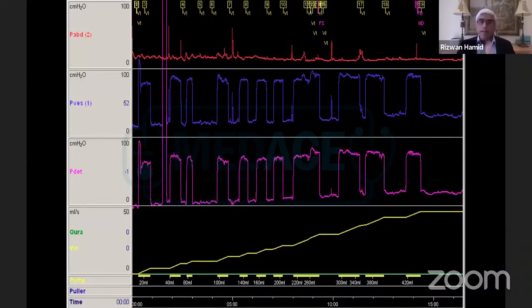I'm going to go back to saying it's pattern recognition. So some of you who have not seen this before say, what is this? Either this is not done well or I can't understand. On the other hand, those of us who have done this test, even if I've not told anything, given no history, would straight away say, this is the urodynamics which is done via the suprapubic catheter or an indwelling catheter, because it's a classical trace which we get when you do the urodynamics with a catheter. Again, pattern recognition.